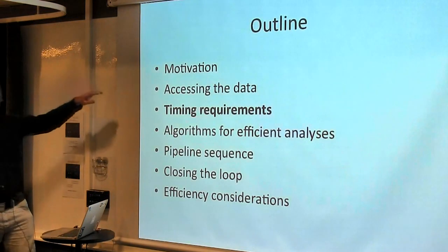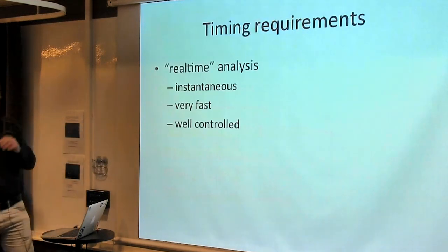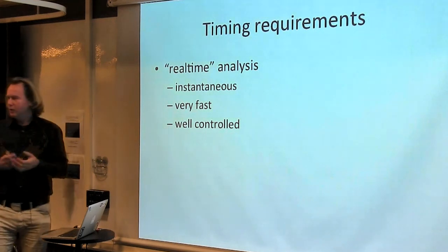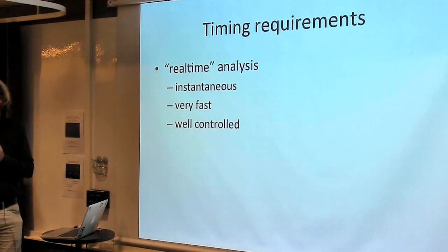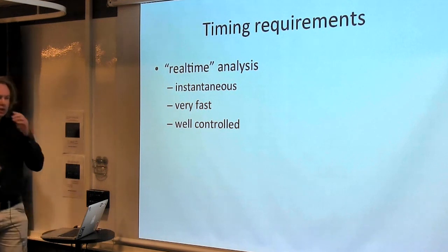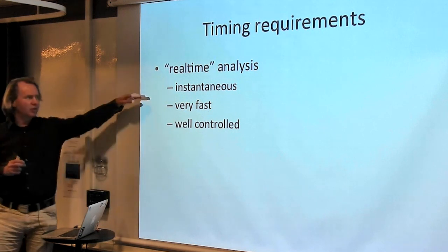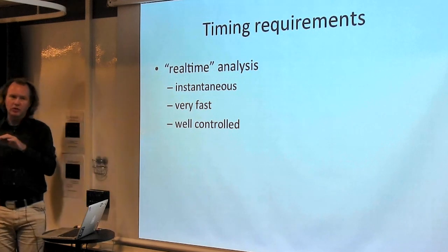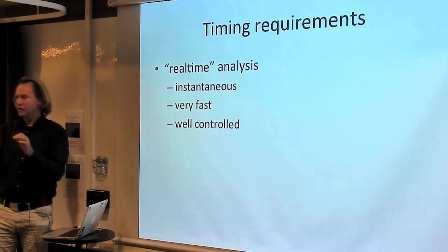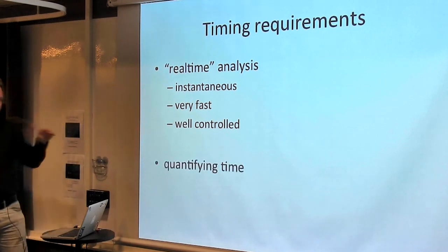Okay, so timing requirements, because that's really the question: is it fast enough? If we think about real-time analysis, we tend to think about real-time as instantaneous. But computers are never instantaneous. Computers are very fast, but they're not instantaneous. More important to think about the requirements here are not that it has to be instantaneous or very fast, but that it has to be very well controlled. Because if you know that you have a fixed delay with which you can analyze the data, then you can compensate for the delay.